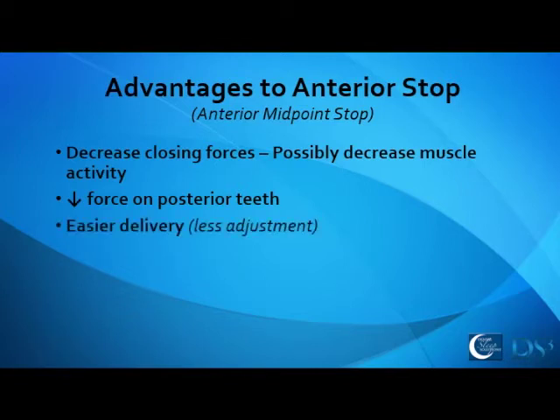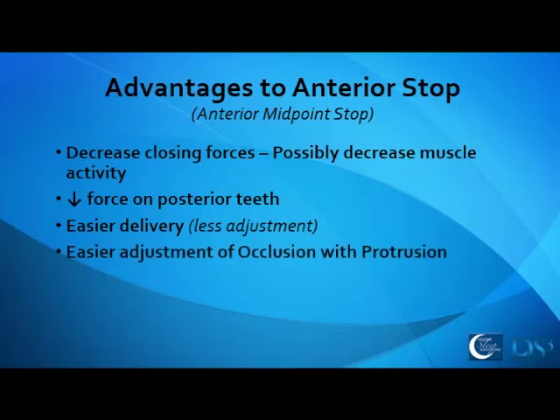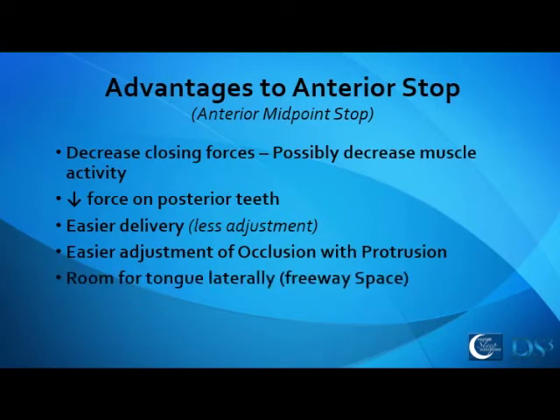It's going to be easier to deliver our devices. They're not going to need as much adjusting because they only hit in one spot as opposed to all the way around. And there's going to be easier adjustment as we go forward in occlusion, because as we move forward, the posterior is going to be out of occlusion. There'll be less areas to interfere. There'll certainly be more room for the tongue on either side, and the posterior laterally will have more room in the freeway space for our tongue.